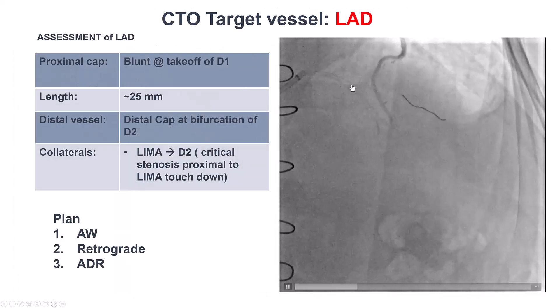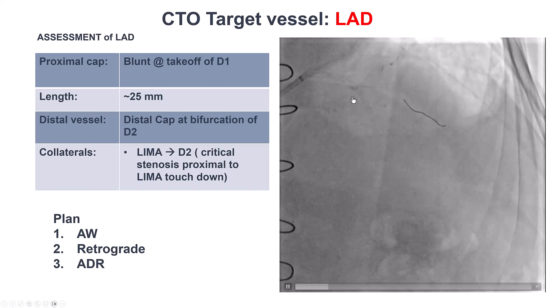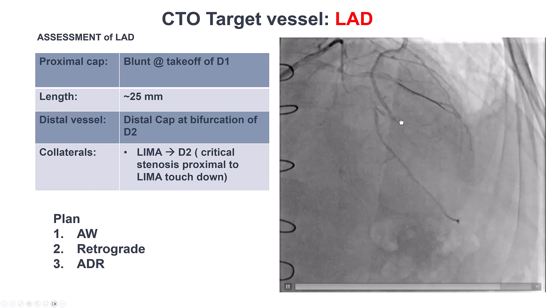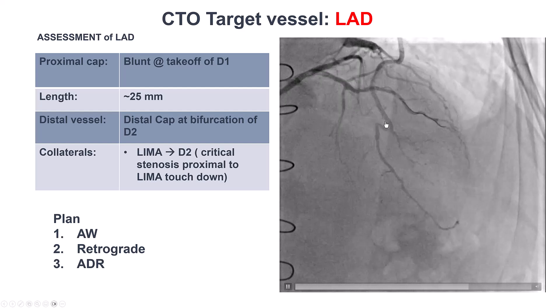We have a blunt proximal cap at the takeoff of the diagonal. The length is about 25 millimeters. There was also a bifurcation on the distal cap with the distal vessel filling through the LIMA. But there was a severe lesion proximal to the touchdown of the LIMA.